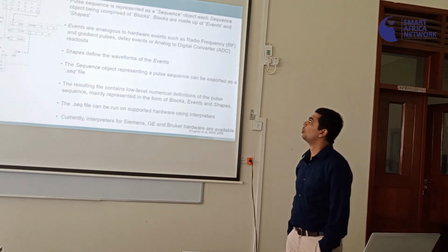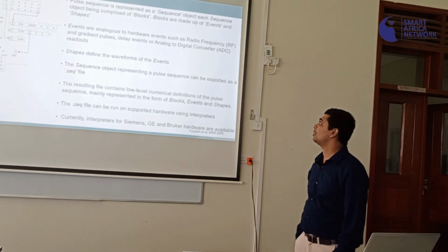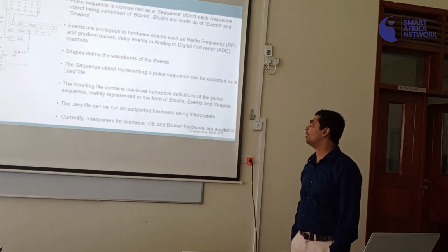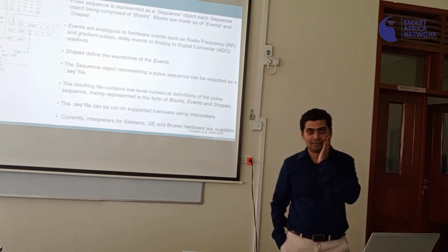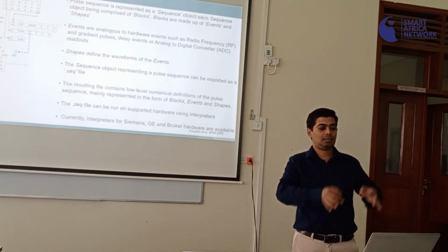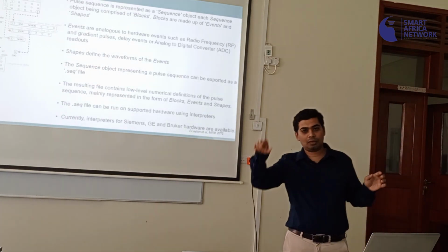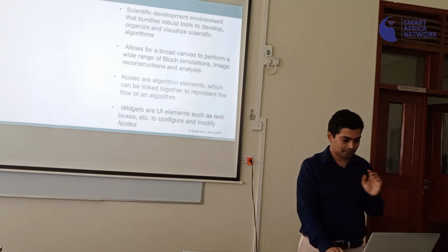Here's how it would look in code. If you go through the first one, horizontally each one is a block, and then within that one horizontal row, you have these columns. Each column is like an event, and each event has a shape. So it's very simple to understand, right? If you're thinking of a wave that's moving, you chop it down in blocks of time, take a block and see, am I playing this block on what coil, that's the event, what is the shape, does it go like a triangle wave, does it go sine, does it go rect, so that's the block event shape.